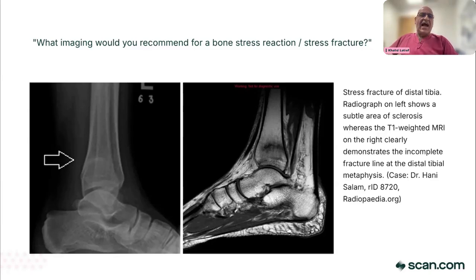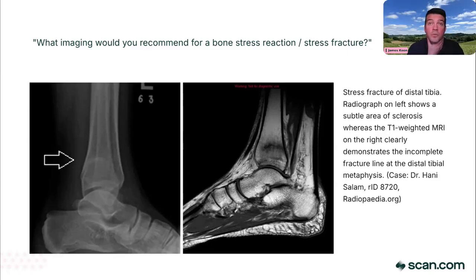James, do you have anything to add about stress fractures? Not about stress fractures. I think we've really covered it. Obviously, the fat saturation techniques in MR give us very good sensitivity for microtrabecular changes. It's been a very long time since I've worked in a plain film department, but there was always a move, constrained by the availability of MR, to move scaphoid imaging for occult fractures, rather than running that 7 to 10 day delay on plain film, straight to MR if it was available, just because it's so much more sensitive.